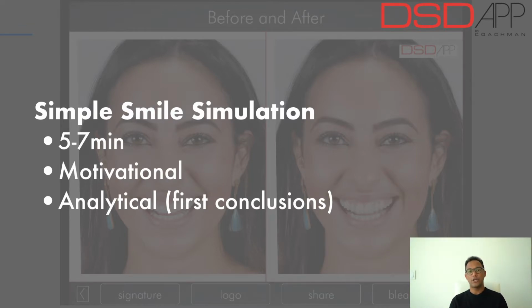What you want to do here is use the app as a marketing tool so you can make your patient understand exactly what you want to propose to them in the treatment plan. So it should be within 5 to 7 minutes. It should be totally motivational and also analytical so you can get the first conclusions, the first idea of what your patient wants for their new smile.